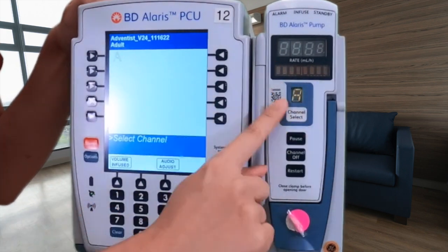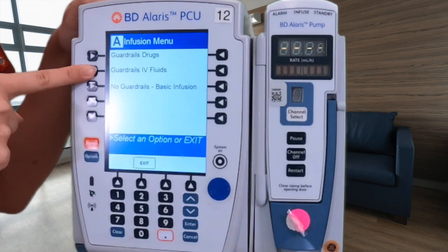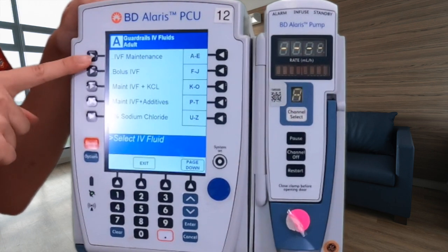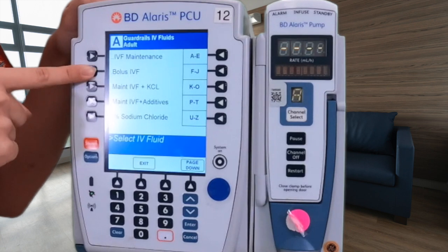We're going to click on channel select because this is the line we're working with. And we're going to go ahead and do guardrails IV fluids. Now we are on this page — you do not select IV fluid maintenance, since this is a bolus we're programming. So we're going to select bolus IVF.